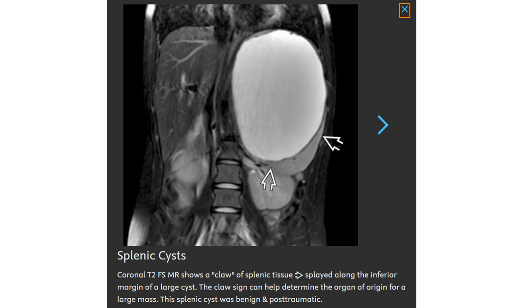This is a T2 fat-saturated image showing a collar of splenic tissue along the inferior margin of the cyst. A collar of splenic tissue can help determine the organ of origin for a large mass. This confirms spleen origin in this post-traumatic case.